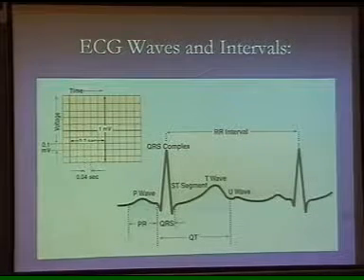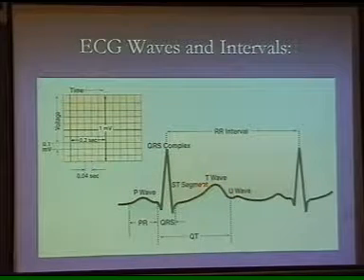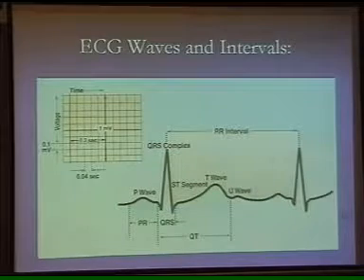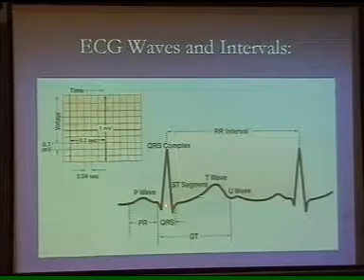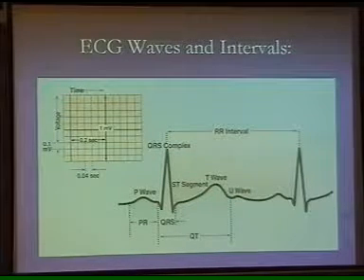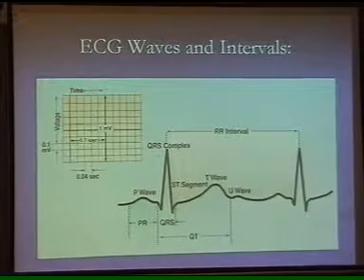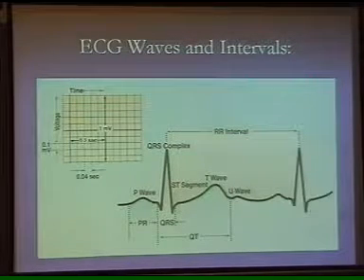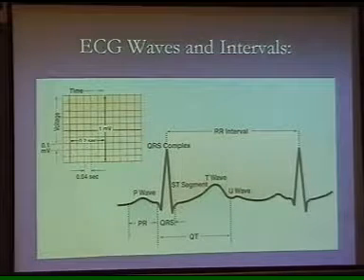You'll see that U wave as well, which is always in the same direction as the T wave, but it is not commonly sought, it's not easily found. So we basically talk about P, QRS, ST, and T most of the time. The P wave is upright in leads 1, 2, 3 and AVF. I'll come to that during the course of the lecture, don't worry about it.